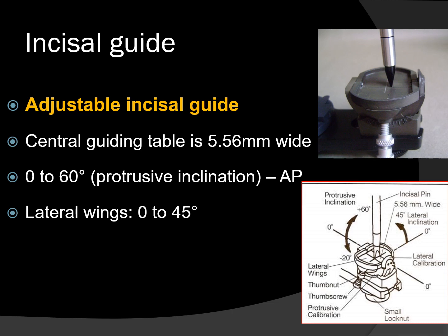Now the anterior control area, which is equally important as the posterior control area, is the incisal guidance. In existing occlusion, this is adjusted in consideration of the vertical and horizontal overlap of the anterior teeth, and in case of an edentulous mouth, vertical and horizontal overlap is determined by aesthetic and phonetic measurement. As per definition, incisal guidance is the influence of the contacting surfaces of the mandibular and the maxillary teeth on mandibular movements. Here you can see in Hanau, it has an adjustable incisal guide, and the incisal guide along with the incisal pin and condylar guidance present a stable three-dimensional programmed guide pattern for the mounted cast.